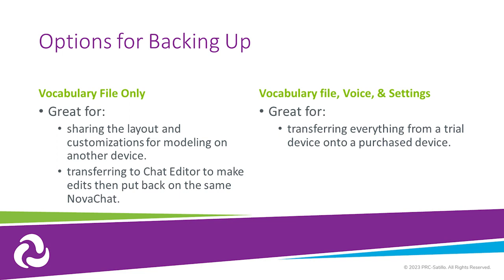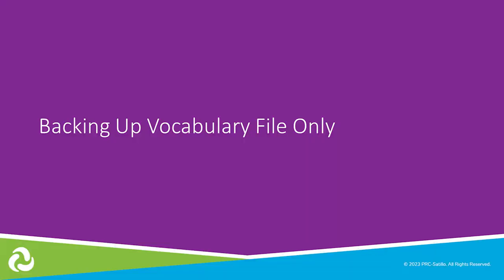One backs up just the customized vocabulary file, which can be useful when you only need the layout and customized words and buttons available. The other option will back up the vocabulary file, the voice, and other settings you have customized on the NovaChat. This is useful when you are transferring everything from one NovaChat to another, especially at the end of a trial. First, let's look at the steps for backing up just the vocabulary file by exporting it to the dual USB.